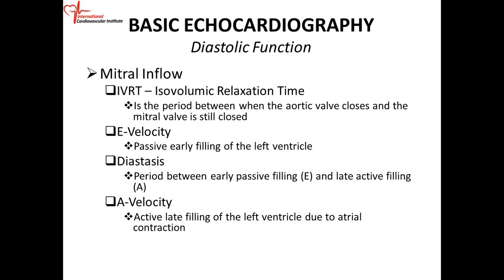There's a gap in time. That period from the aortic valve closure to the mitral valve opening, that's what we call the IVRT, the isovolumic relaxation time. So it is the period between the aortic valve closure and the mitral valve opening. If you look at it, it's a period of time when all the valves are closed. So that's the time you're measuring.